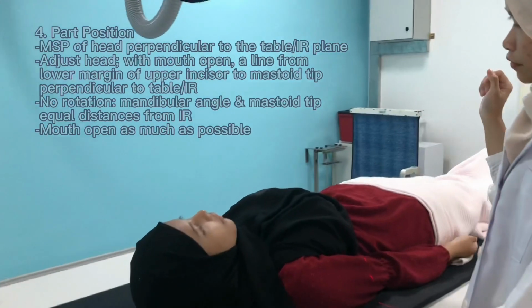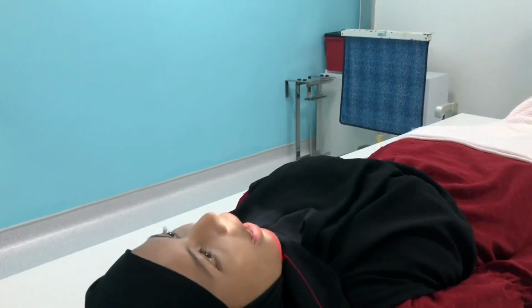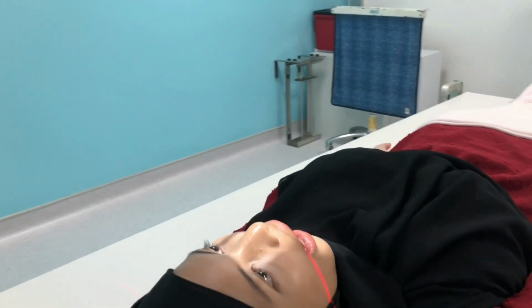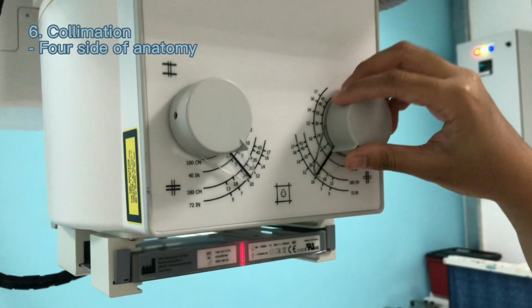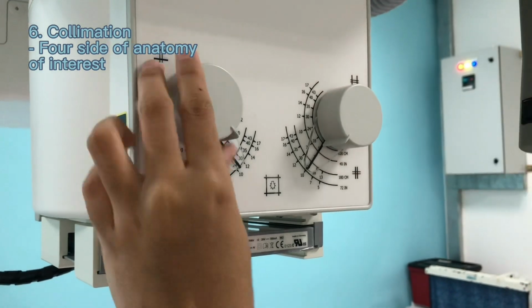Can you open your mouth? For CR, we must direct the CR to the center of the open mouth and make sure to center the IR to the CR. Next, for collimation, we can take 4 sides of the anatomy of interest.